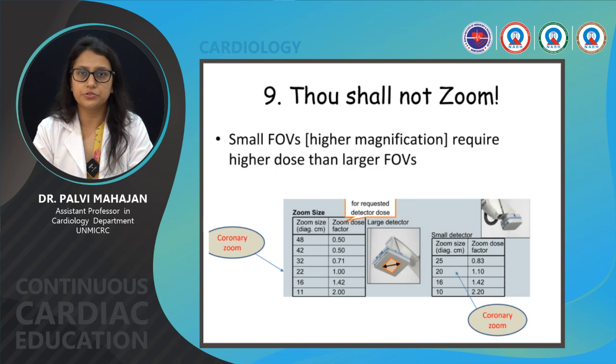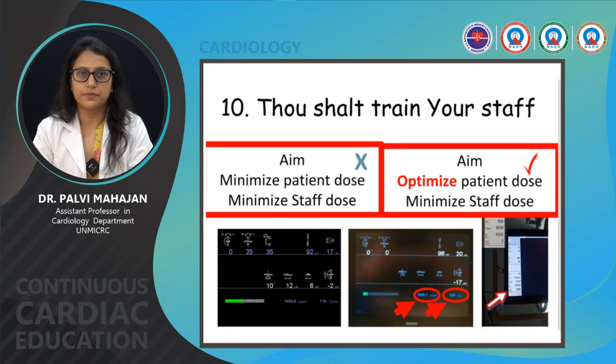Thou shalt not zoom. For small fields of view, higher magnification, it requires a higher dose than the larger fields of view. Thou shalt train your staff. The aim should be to optimize the patient dose and to minimize the staff dose.